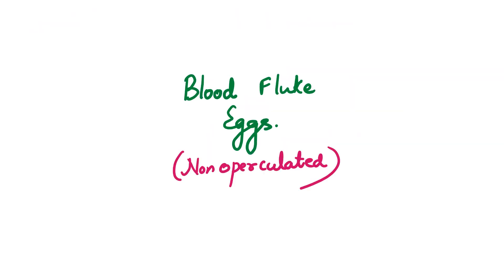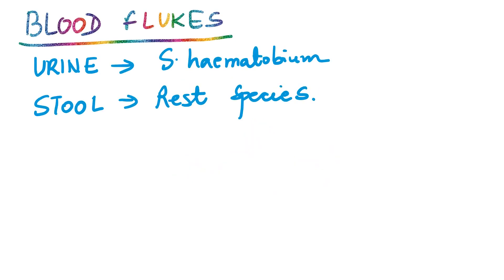Next, we move on to the blood flukes. These produce non-operculated eggs. Blood flukes are Schistosoma species. The word Schistosoma starts with S — so instead of an operculum, they have something starting with S: spines — terminal spine, lateral spine and so on. Most blood flukes — mansoni, japonicum, intercalatum, mekongi — are found in stool, because all adult worms of schistosomes are found in the mesenteric plexuses.